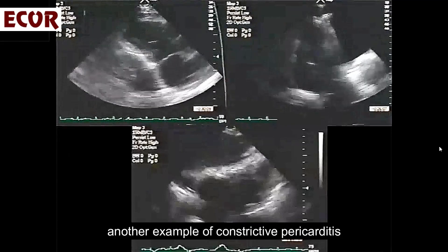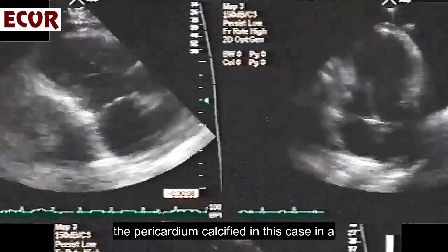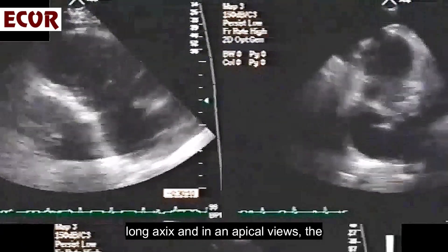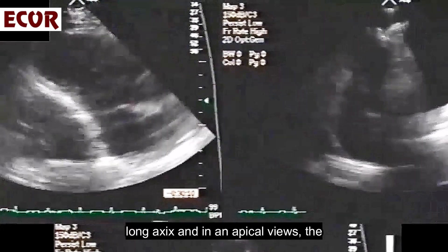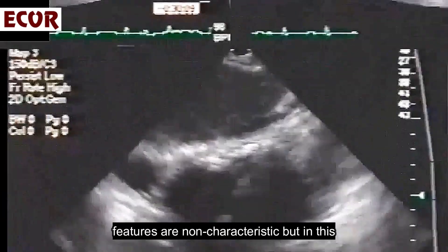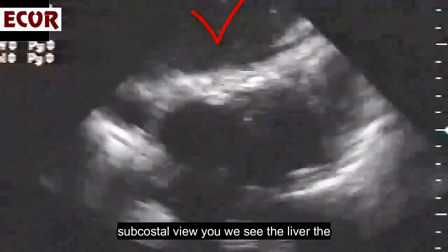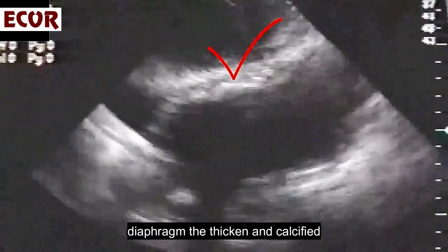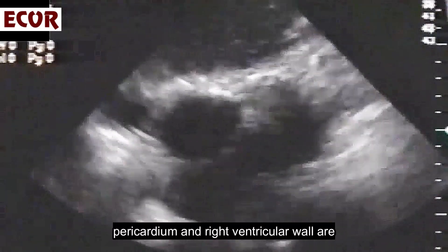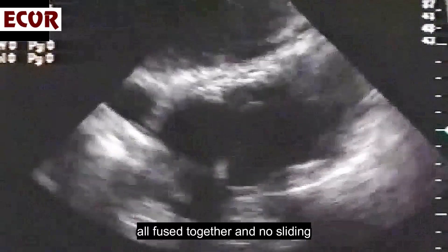Another example of constrictive pericarditis — the pericardium is calcified in this case. In a long axis and in an apical view, the features are non-characteristic. But in this subcostal view, we see the liver, the diaphragm, the thickened and calcified pericardium, and the right ventricular wall, all fused together with no sliding.